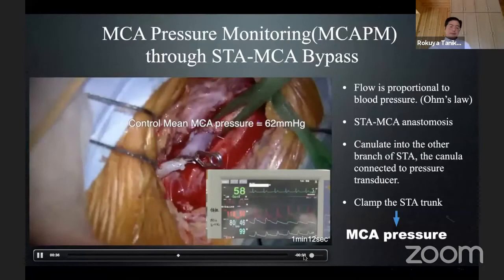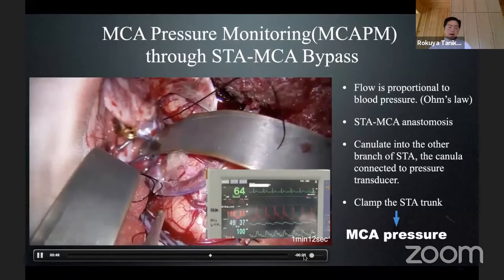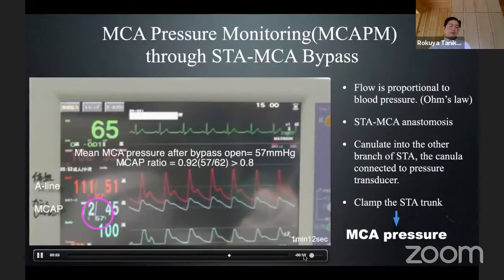After ICA occlusion, we can see the MCA pressure decline — from 62 to 43 mmHg. By opening the graft, the MCA pressure recovered from 43 to 57 mmHg — 92 percent of the control MCA pressure. This is real-time monitoring of graft functioning.